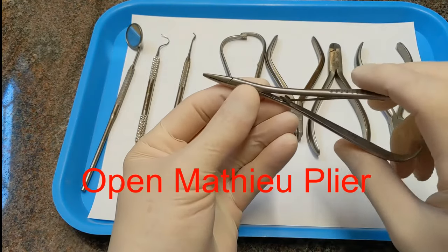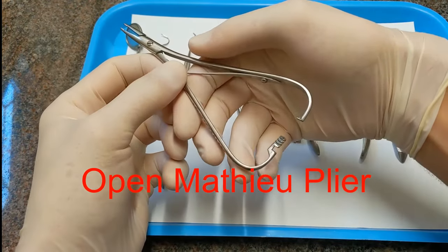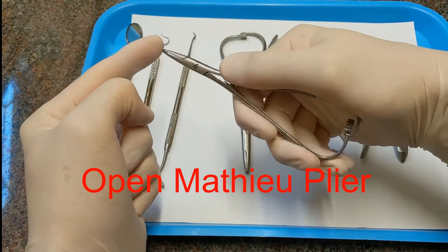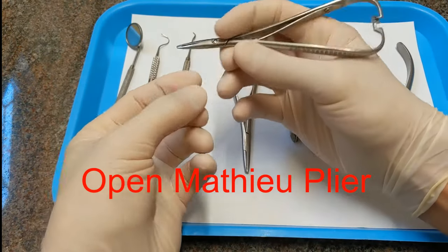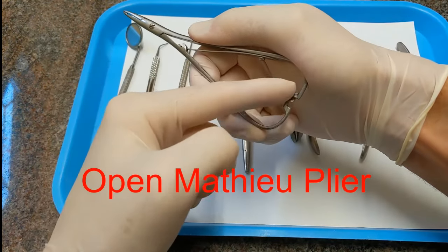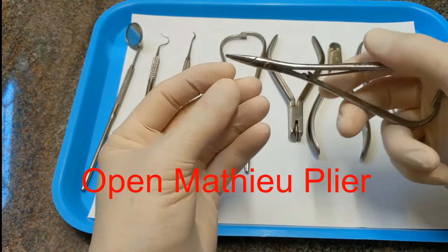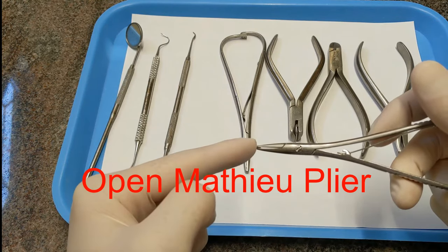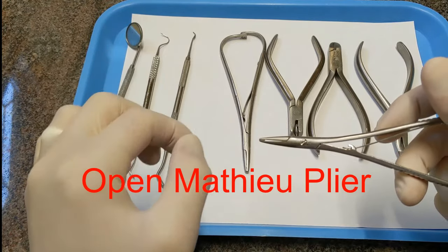This is called an open Mathieu — it's a Mathieu plier. It has this ratcheting end that ratchets shut. When you click it, it locks closed, so you can grab single ties or chain and it will lock on there. To release it, you just continue to squeeze and it opens. It's called an open Mathieu because the jaws only touch at the end and the middle is open — it's meant for really pinching things.